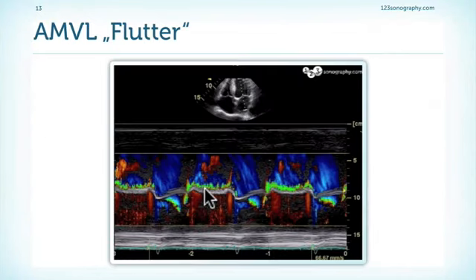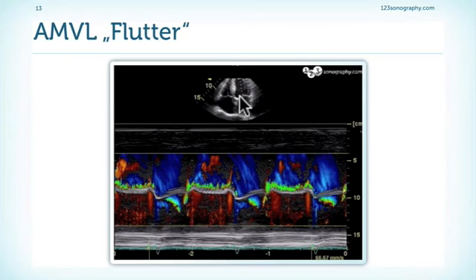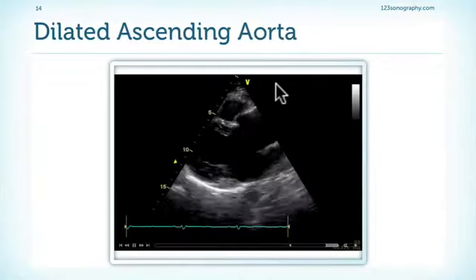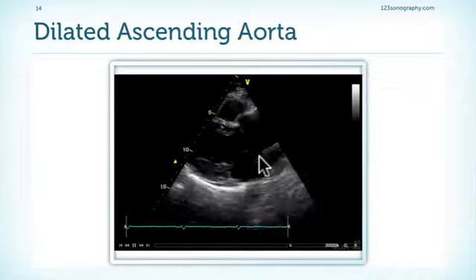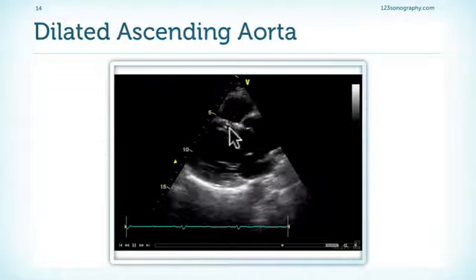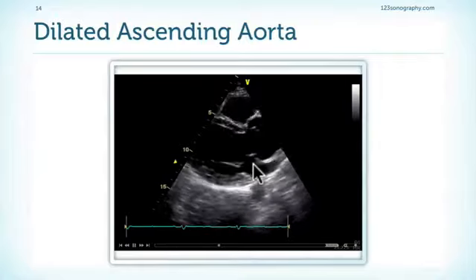An M-mode tracing of the anterior mitral valve leaflet shows flutter of the anterior leaflet caused by an eccentric jet blowing into it during diastole — a phenomenon frequently seen and which can also be heard, corresponding to the so-called Austin-Flint murmur. Additionally, a dilated aorta is seen in many patients; the dilatation can either be the cause of aortic regurgitation or can be associated with bicuspid valves, which frequently have regurgitation.